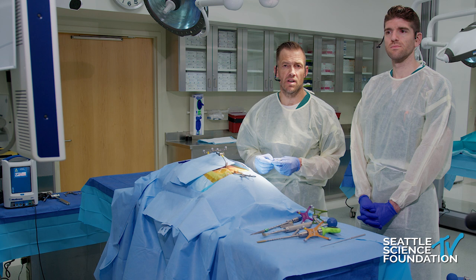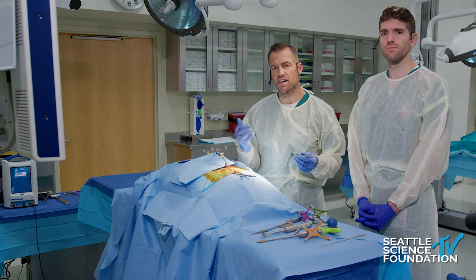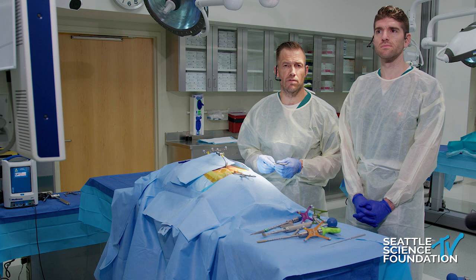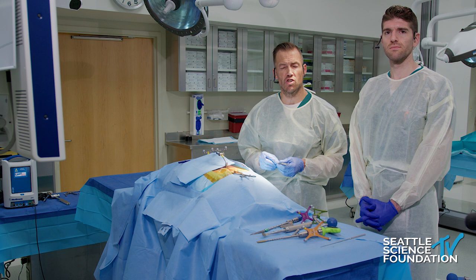At the beginning of my career placing and stacking these devices, I was using primarily intraoperative fluoroscopy, and it wasn't until later that we began adopting enabling technologies. If you're one of the majority of spine surgeons without access to these technologies, it does not prevent you from doing this. You can reference last year's talk for tips on intraoperative fluoroscopy. Today we're using O-arm and Stealth to demonstrate a similar S2 alar iliac trajectory while stacking it with the granite device.